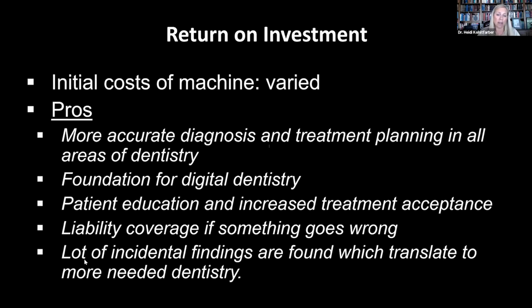So you can use the DICOM files from your CBCT to do pretty much anything that you want, all the way down to 3D printing and 3D segmentations, of course, your implant treatment planning, that sort of thing. And so there's a lot you can do with these. Patient education, it's great for patient education. They love to look at themselves. First of all, you just think about all the selfies that are out there, but imagine zooming through yourself. Very, very exciting and fun for patients.